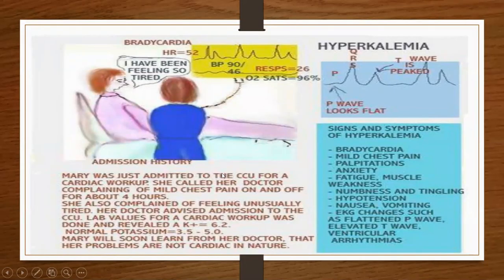So here we have a patient, and she says, "I've been feeling so tired." Her strip is showing bradycardia. But now let's look at her strip, and we see her P wave is flat, her QRS is wide, and here she has that significant peaked T wave right here.